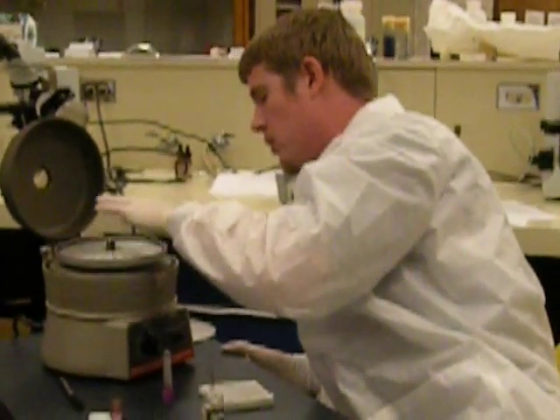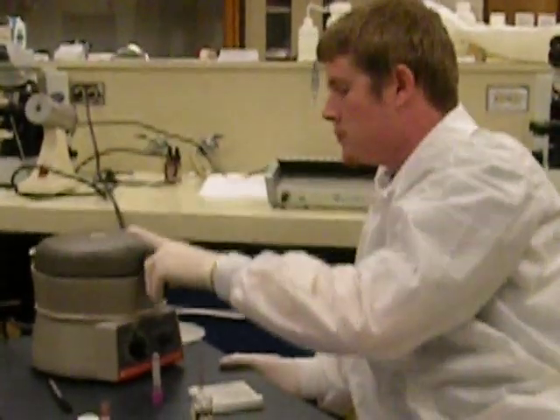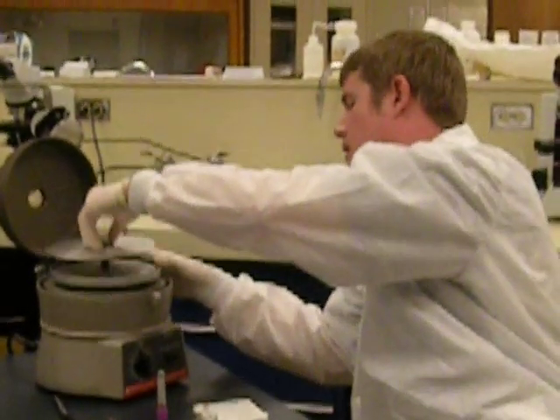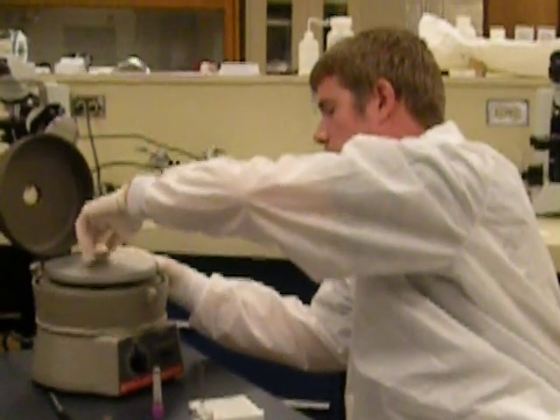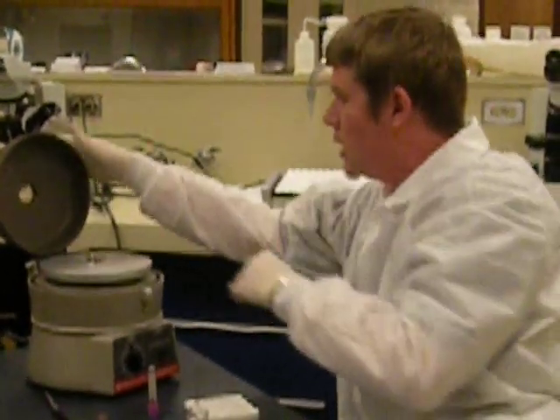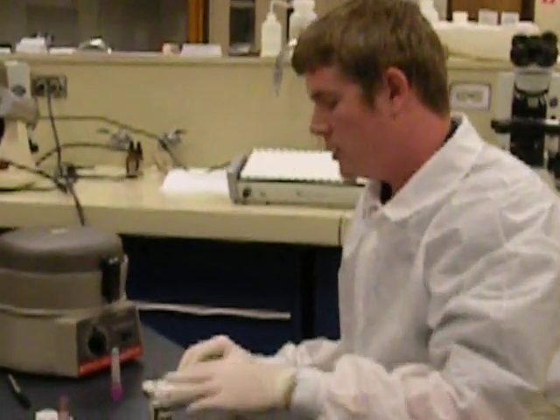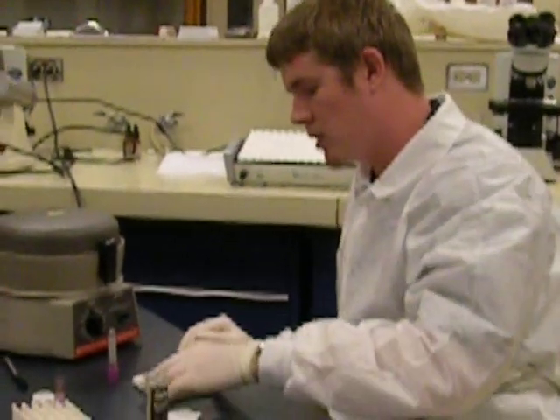You're going to want to make sure that you push both capillary tubes toward the outside. Don't forget — this cap screws on top. Close it and spin for five minutes. Since this is only a 10-minute lecture, we went ahead and did some beforehand.